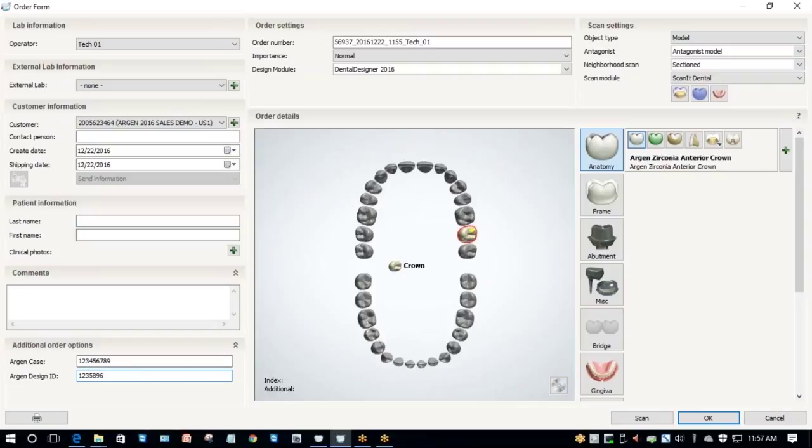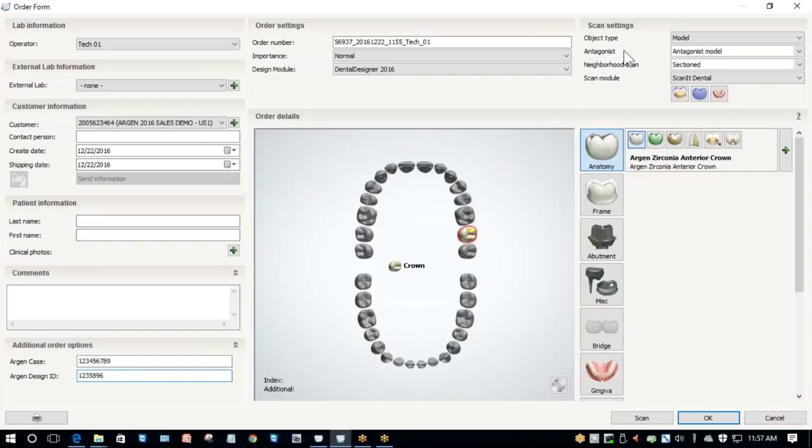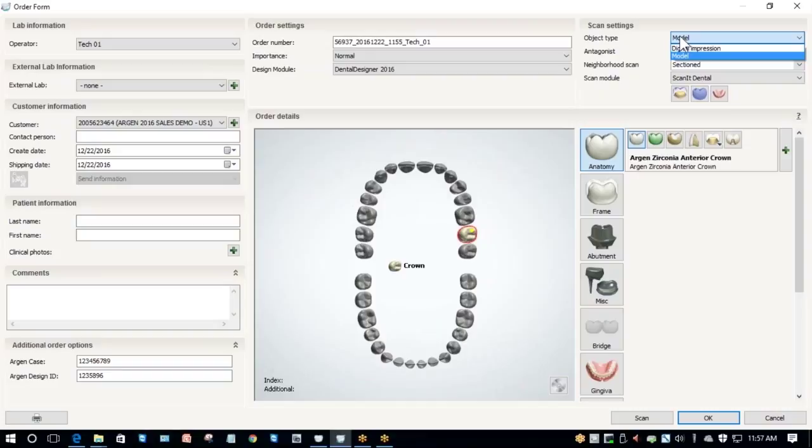Most of the time, the default options for scan settings will vary depending on what I've selected. Because I've selected a crown, it's automatically assumed that I've got an antagonist and a section model. First, Object Type is what you're scanning. Normally, most people are going to be scanning models, so you're just going to leave that alone.